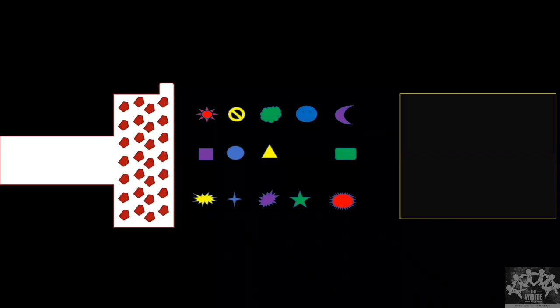Yes, if you want to differentiate between a stone and air, usually the first thing is you see the position, then you do color Doppler, then there are a few other points. I am going to tell it soon. There are some artifacts which will also give some clues. See, in radiology you can't directly say this is stone, this is air. We need to correlate it, and we need to do different techniques to find out whether it is stone or air. There are so many other small findings which I'll tell one by one.